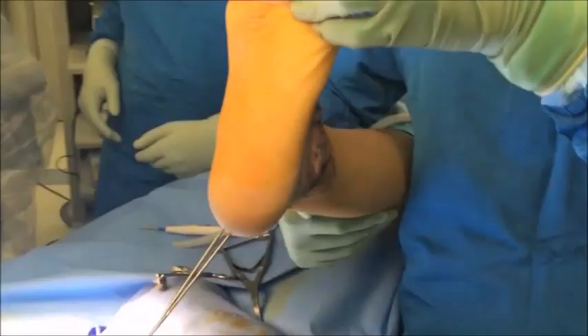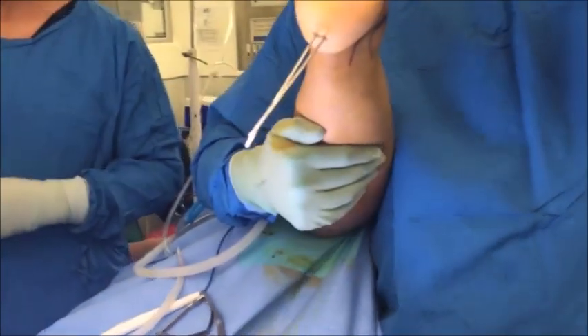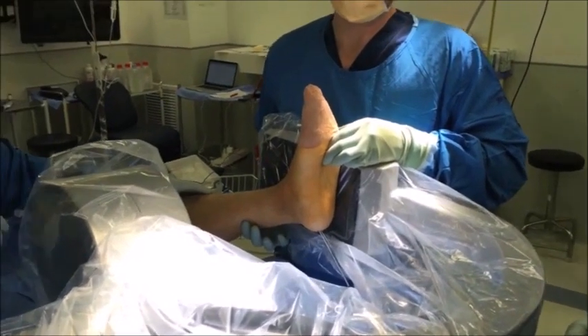Alignment can be checked visually by lifting up the leg and confirming that the heel is in approximately five to ten degrees of valgus relative to the lower leg. Correct placement of the K-wires is then checked under fluoroscopy on both the AP and lateral views.